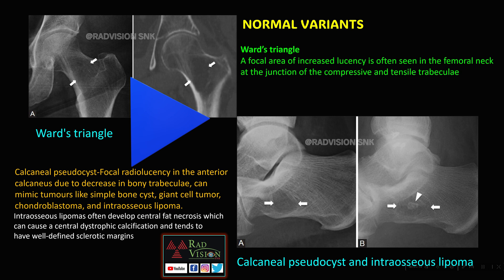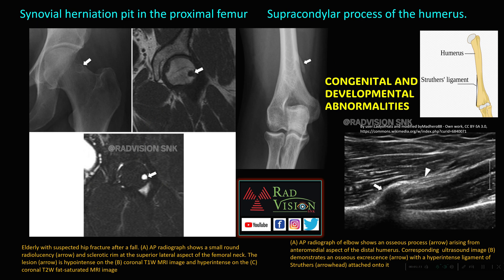There are also anatomical variants and congenital or developmental abnormalities. Here you can see a lucent area with sclerotic rim in the superolateral aspect of the femoral neck, hypointense on T1 and hyperintense on T2 and fat-suppressed images — this is called a synovial herniation pit in the proximal femur. Also there is an osseous process arising from the anteromedial aspect of the distal humerus; on ultrasound, there is the hyperintense ligament of Struthers attached to it — this is the supracondylar process of the humerus. The Struthers ligament attaches from the supracondylar process to the medial humeral epicondyle. These should not be confused with tumors.